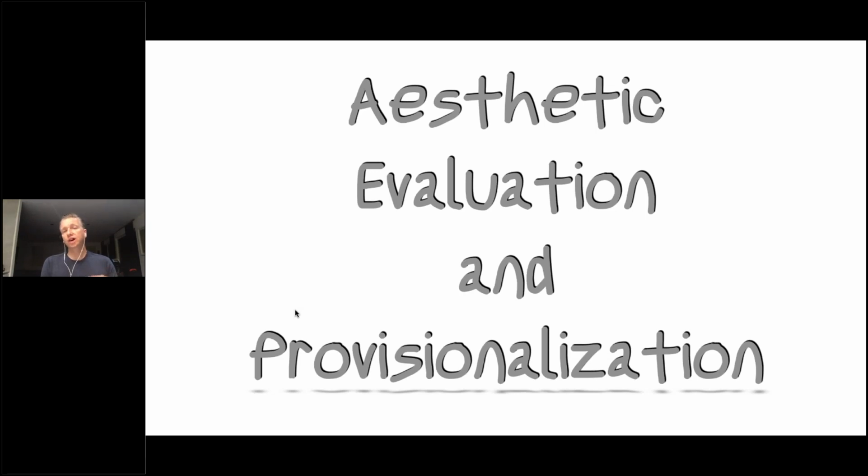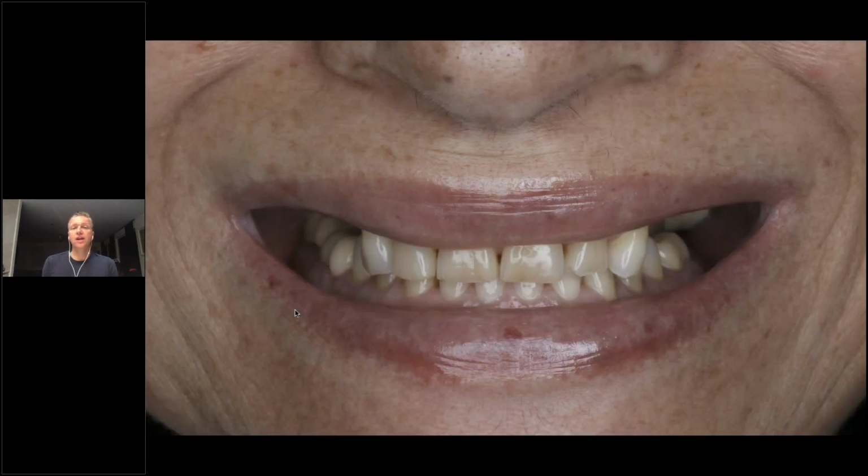I want to go into more detail on how to transfer it in real life into a patient's face. This patient, Gina, presented with an absolute collapsed smile, or collapsed bite. Why collapsed? Because the upper posteriors have been missing for years. Finally she got 4 implants placed, 2 on each side, for 3-unit bridges, one on each side, implant bridges.